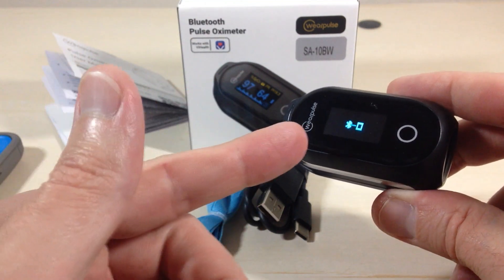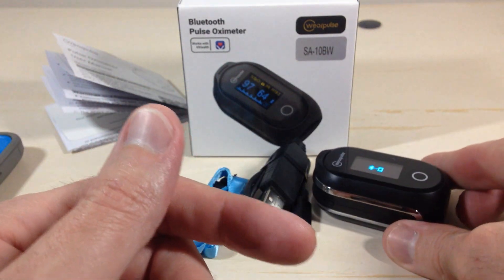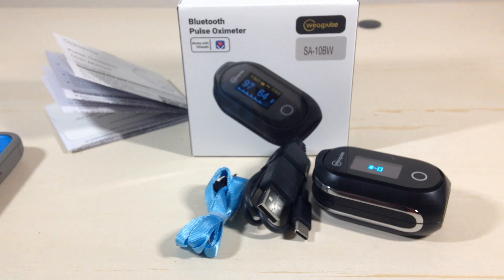Really simple to use, very easy to see. That's a quick look at the WearPulse Rechargeable Bluetooth Pulse Oximeter. I hope the video helped.